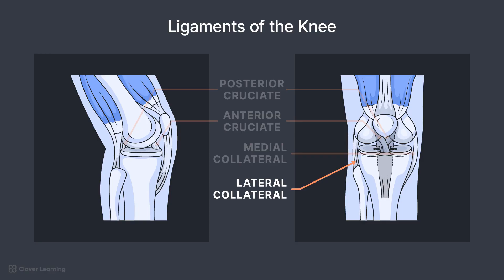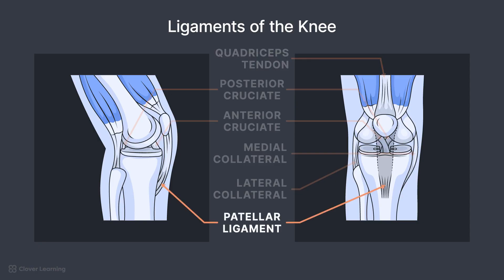Other important structures are the quadriceps tendon, attaching the quadriceps muscle to the patella, and the patellar ligament, which attaches the patella to the tibial tuberosity.